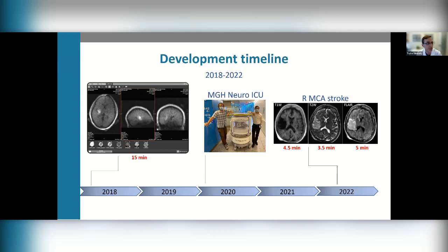Of course, one other element that is embedded in a portable MRI is really a fourth dimension. And that's what really is, at least as a clinician, the most exciting aspect about this technology from my perspective, as I'm sure it is from yours. And that's the accessibility and portability, so that this fourth dimension allows us to conceive of applications for this scanning technology in arenas that previously were unimaginable for conventional MR.